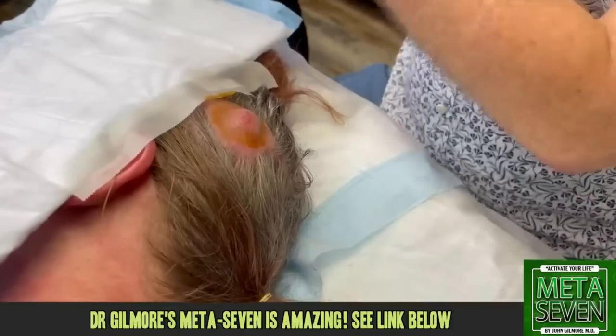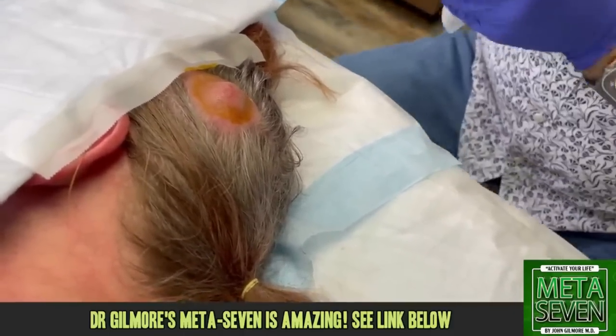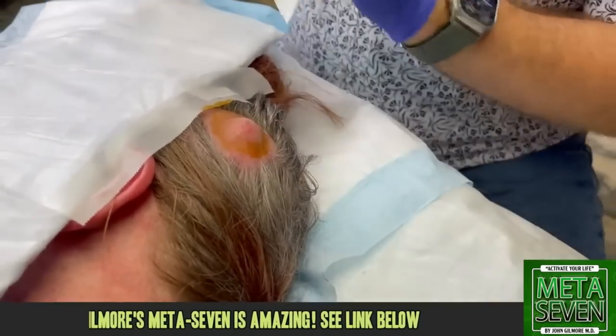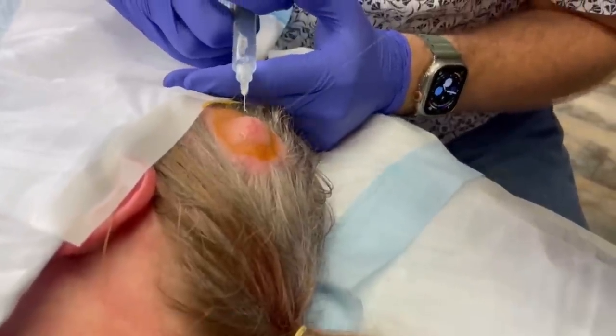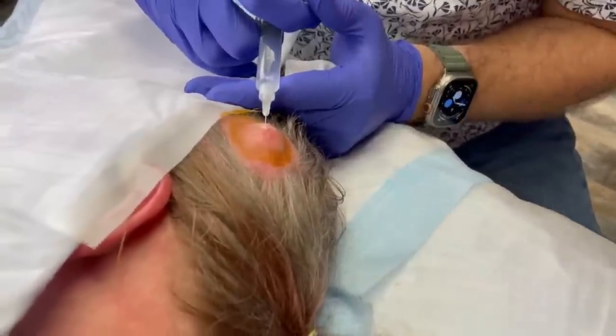So this one is twice the size. Much larger. All right, we're going to get cold spray again. Yeah, she's serious about that cold spray, too. Look how windy it is. I think it might rain. Ready? Yeah, go ahead. Right there. Perfect. Stick, a sting, and a burn. You ready? There we go.